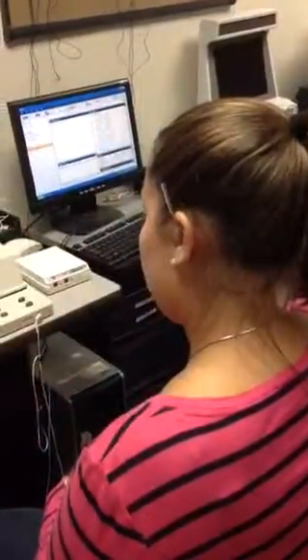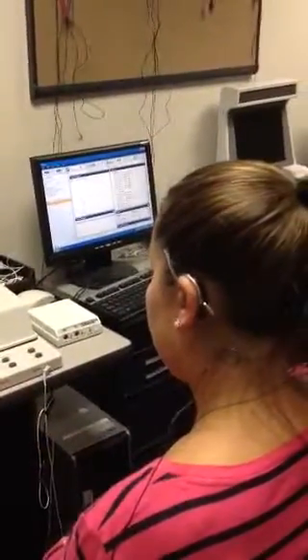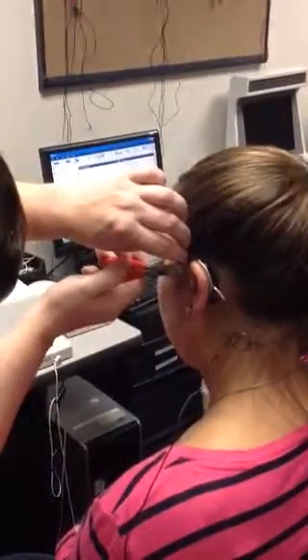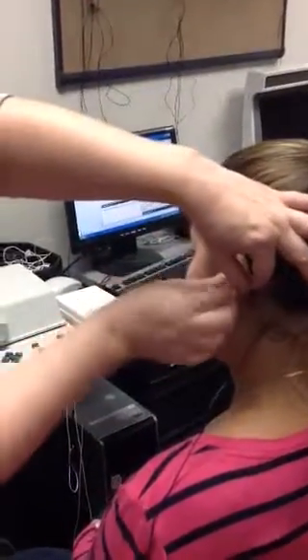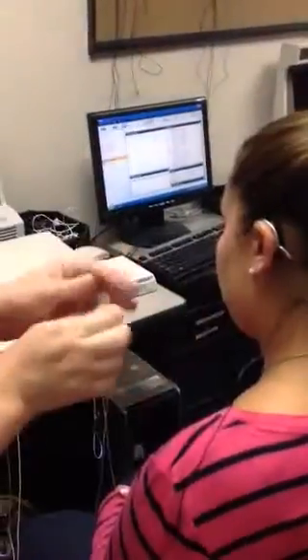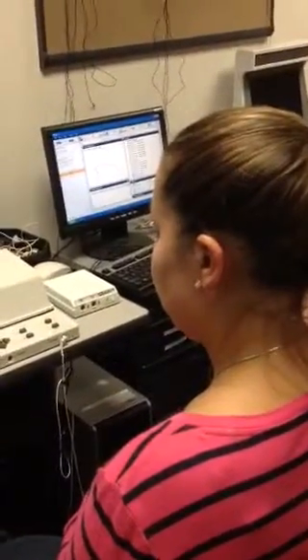I have to cut her ear mold. So I'm going to fit her. So this will be trimmed so you can attach it now to any hearing aid. All I did was just score that so I know where to cut when I take it off. Oh, that's smart. I don't know why I never did that before. What, just score it? Yeah. You can mark on it with a Sharpie or a pen if you want to know where you're going to cut. Whichever way you think is easier.